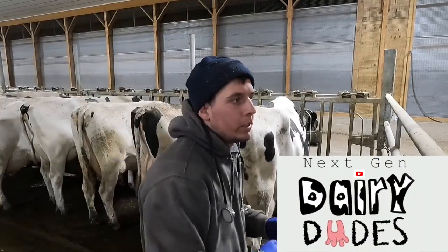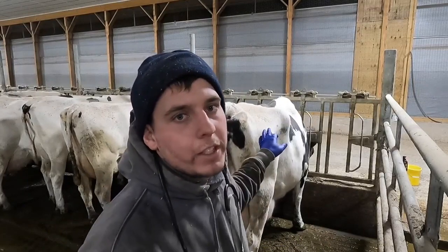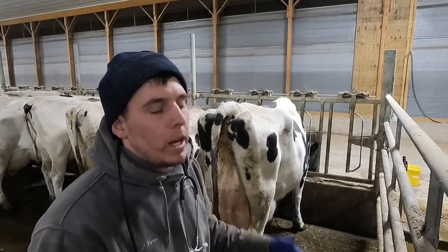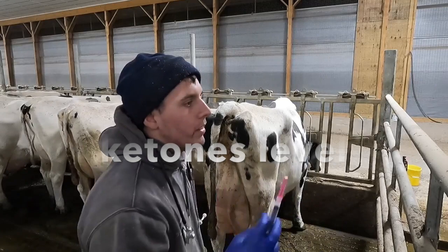What's up, dudes and vets — I just want to show you a little bit of what we do as far as treating cows. I got this fresh cow here, 2068. I'm going to show you what I do to go through and diagnose some of the problems that we have. First thing I'm going to do is take her blood and test that.